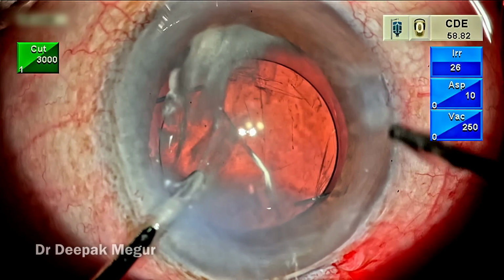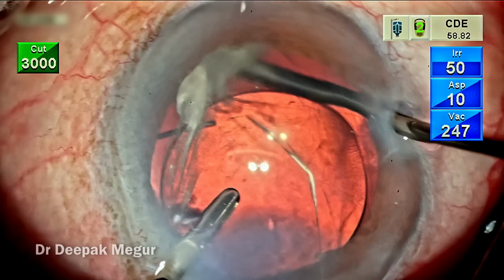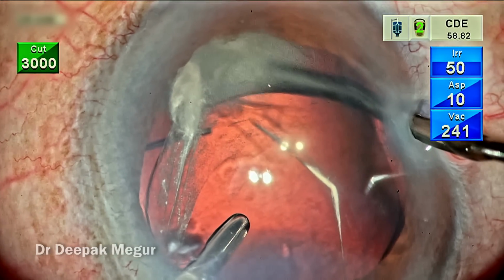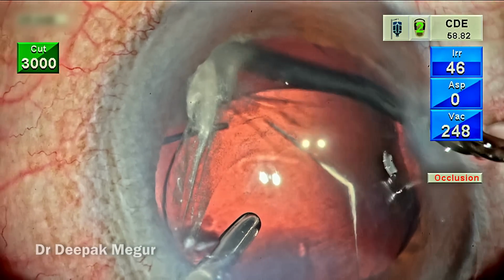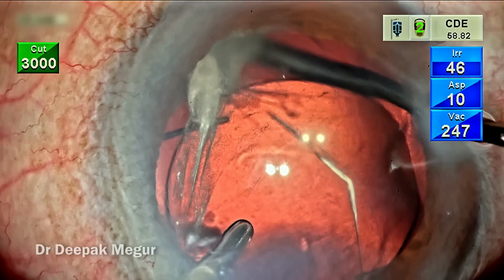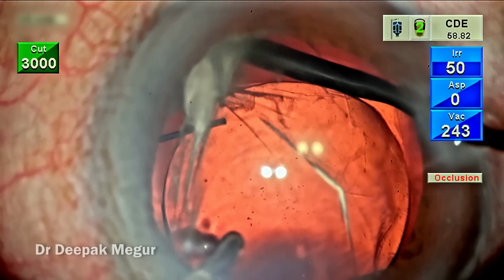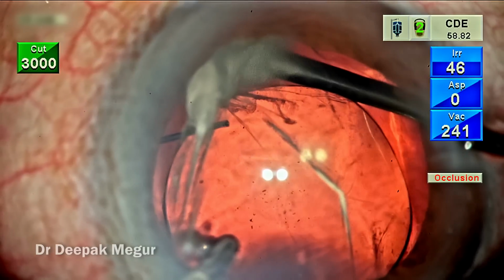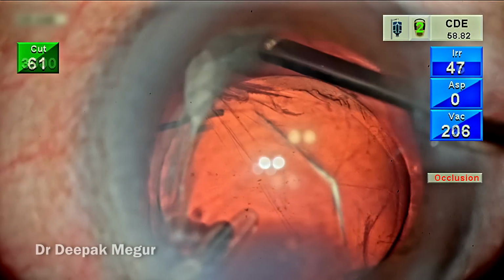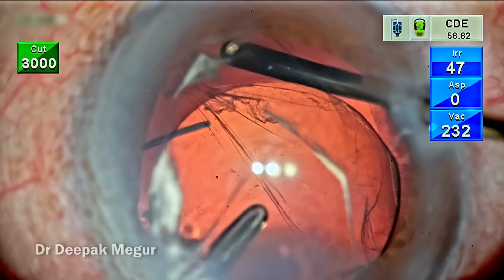And nevertheless, we need to deal with the vitreous first. See, the important point here is we need to do the anterior vitrectomy without sacrificing the posterior capsule or the anterior capsule, so that we still have enough support for the lens to be stable in the posterior chamber, in the sulcus. The positioning of the cutter is extremely important. It is positioned below the level of the posterior capsular tear with its bevel down first, and the cutting has begun. So once the vitreous which is behind the posterior capsular tear is taken care of, the bevel is now turned sideways and finally anteriorly to take care of the prolapsed anterior vitreous.